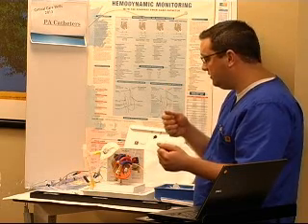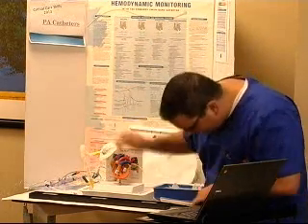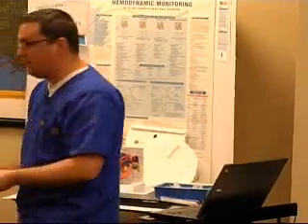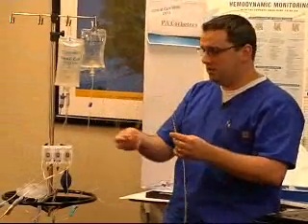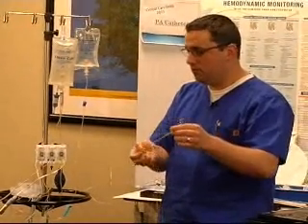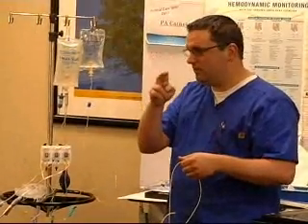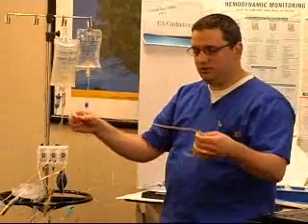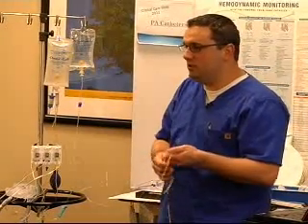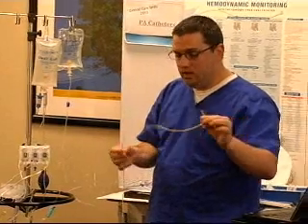The other concern, and this is another good reason why you want to look at your x-ray, is your PA catheter may actually be twisted or in a knot. And you say, how could it be in a knot? Well, it's actually possible that it can be looped over itself in the ventricle. So whenever you go to pull this out, make sure you're looking at that x-ray, and that you have a straight, steady line from where you're coming in all the way around to the tip, so that you don't end up trying to pull something out and it won't come out. Don't force it if it gives resistance. You want to go nice and steady and slow, but if you do get resistance, you don't want to pull hard, okay?